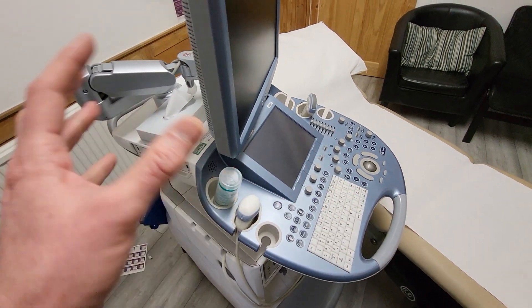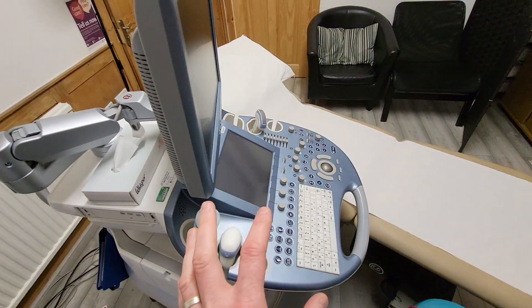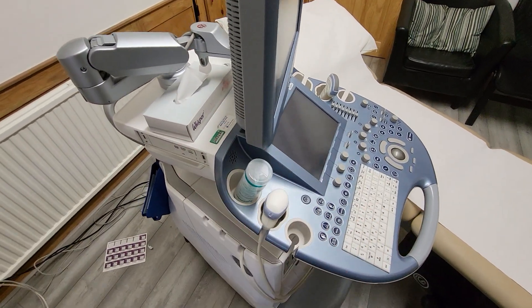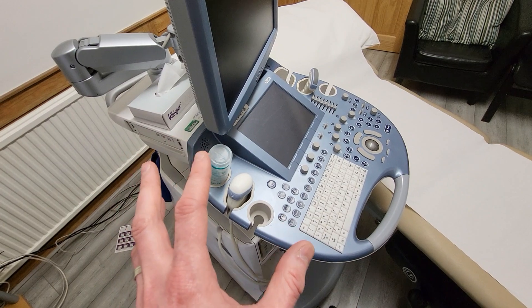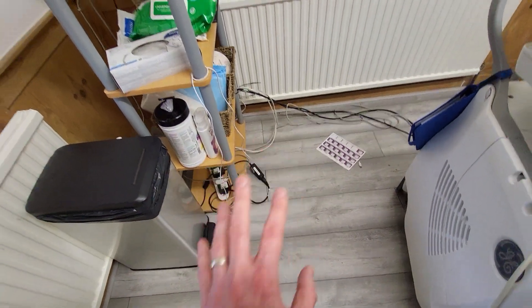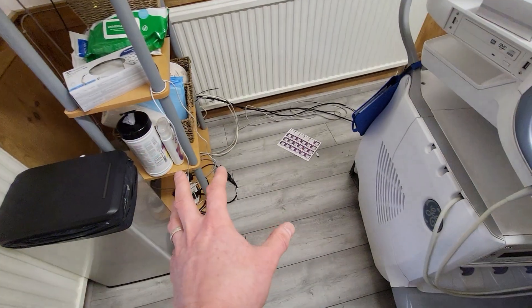There are extra tests and things that need to be done on medical equipment because they are coming into direct contact with patients, which is why there's a completely separate test. When I'm in a medical situation like this, there are other things like adapters, laptops, and lamps that all still need to be PAT Tested.